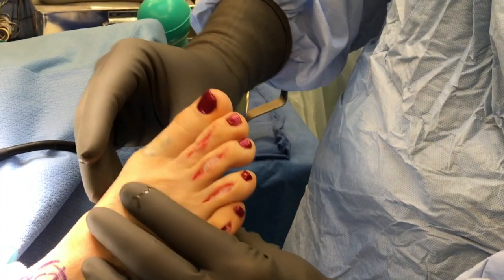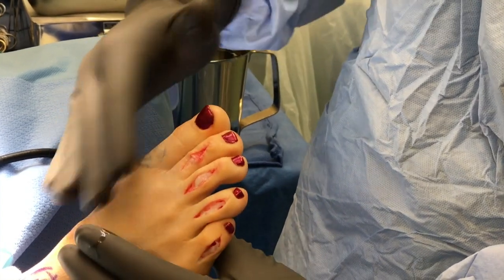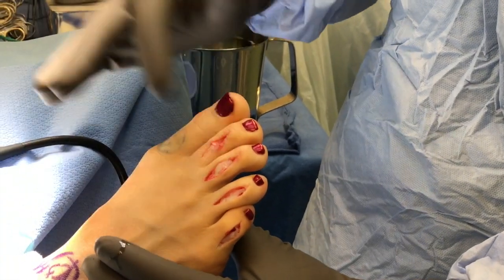Now, say that's a little bit too straight, which I think it is. I'm going to kind of slightly bend it now — and there we go. A natural-looking toe that's not too straight, no metal, and of course the corn will be gone too.